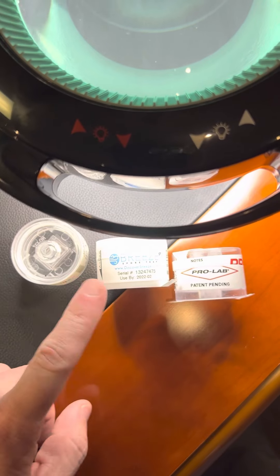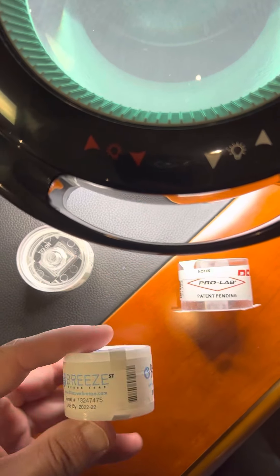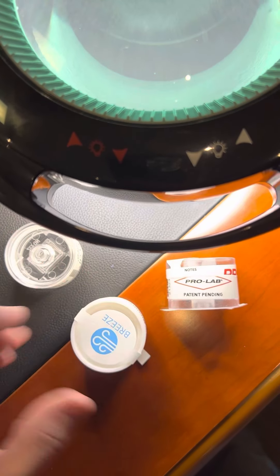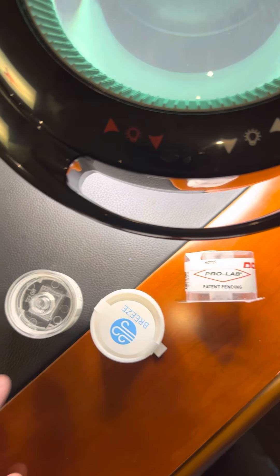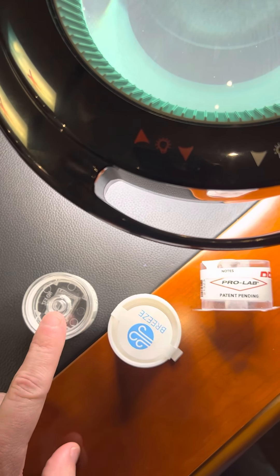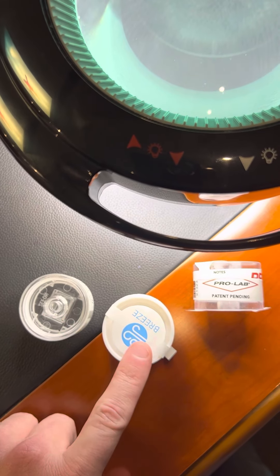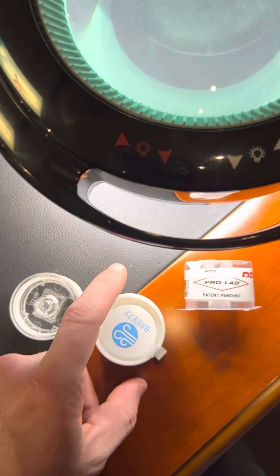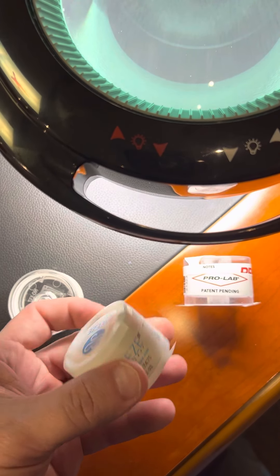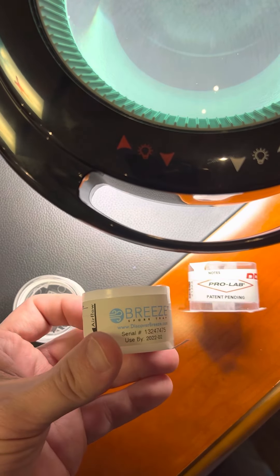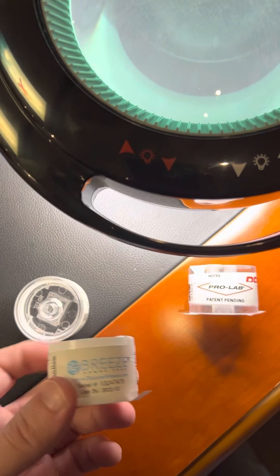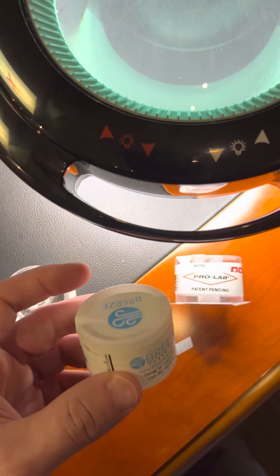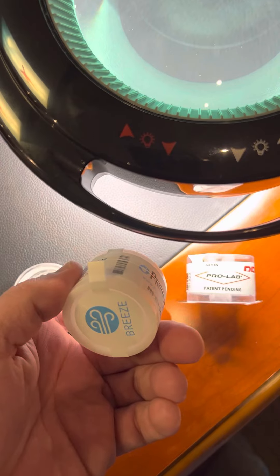This right here is the Breeze ST. Now this is the AeroCell. This is the ST. This goes for about $5. These things we sell, depending on volume, as little as $3 a piece.